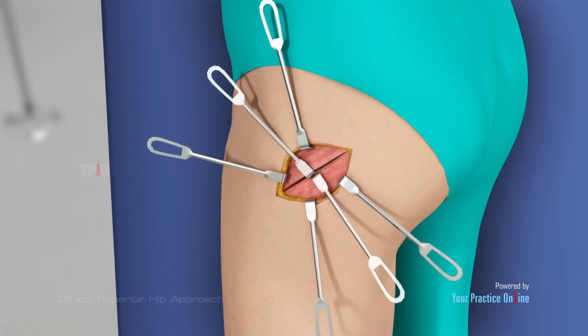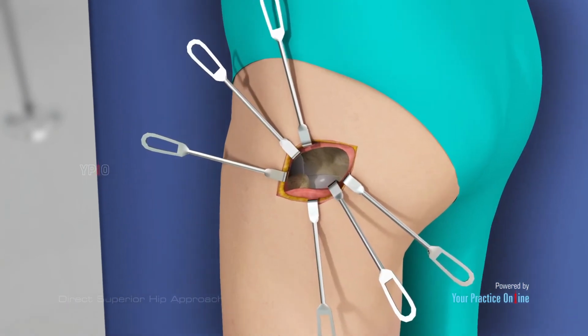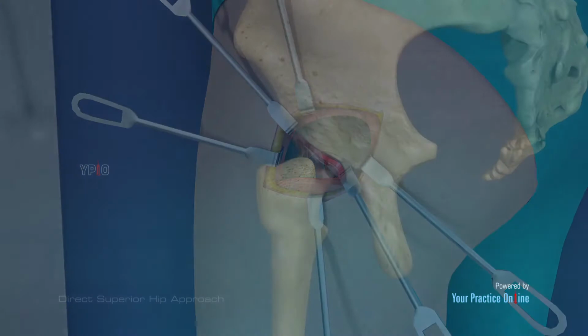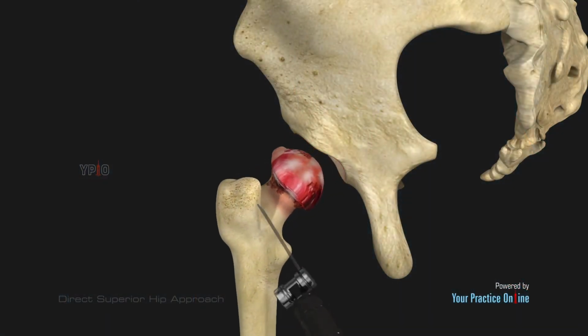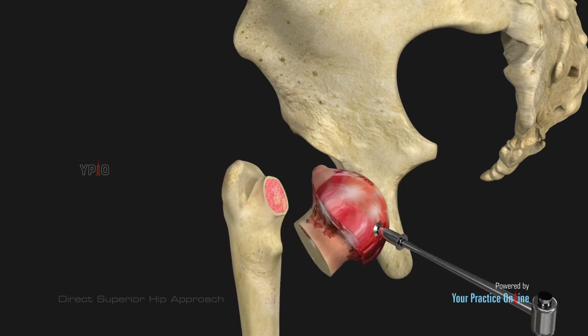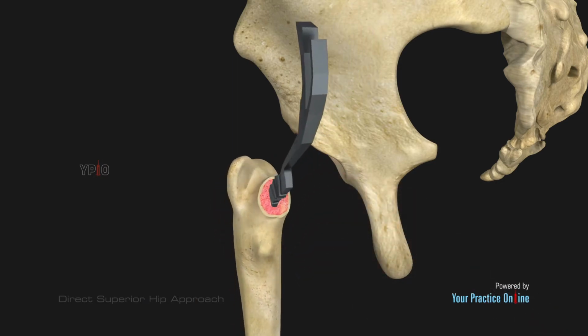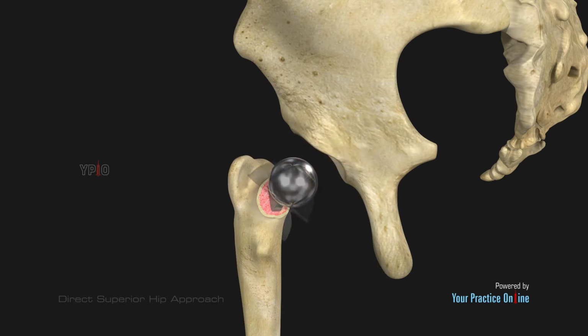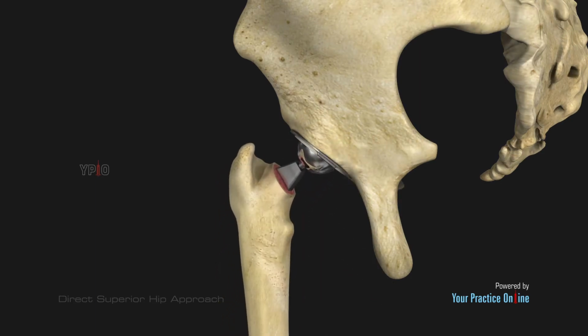The hip joint is accessed through the gluteal or buttock muscles without injuring the iliotibial band and external rotator muscles of the hip. Instruments are used to retract the muscles and soft tissues. The capsule of the hip joint is entered from above. Instruments are used to remove the damaged or arthritic bone and to prepare the femur and pelvic bones to receive the implants. The implants are placed and hip movement is assessed.